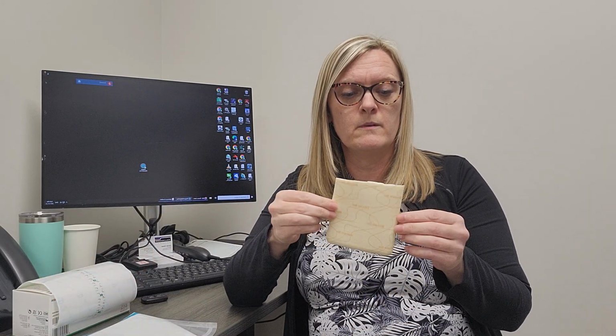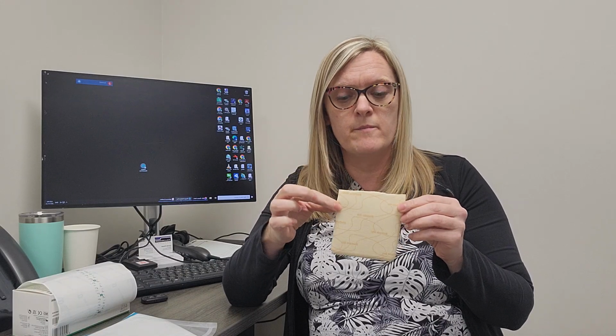So one of the foams that I use here, which is available on the catalog, is the Biatain Ibu, which is impregnated with some ibuprofen. So every centimeter square of this foam has some ibuprofen in it, which is really great to use topically when there's a lot of pain. It's also really great on a drier or moderately exudating ischemic wound, because when you can control some of the pain, you can actually reduce some of the ischemic changes that are happening.